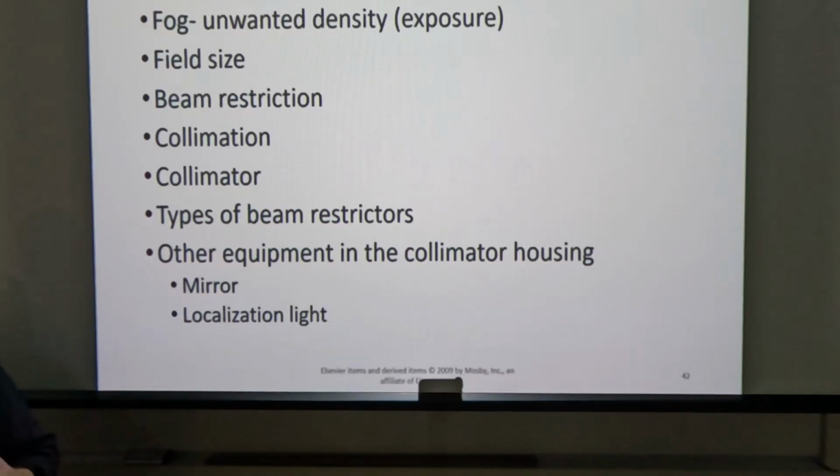What you'll find in the fall, somebody will probably do an experiment on collimators. And what you'll find is collimators are not that hard to penetrate. You can close them completely, all the way, and make an exposure, and you'll still get an exposure on the image receptor. But if you've got this big heavy chunk of metal that extends all the way up to the patient's skull, you're not going to get just a whole lot outside of that. So anything outside of the projected radiation field is just created inside of the patient. So very, very effective collimators.